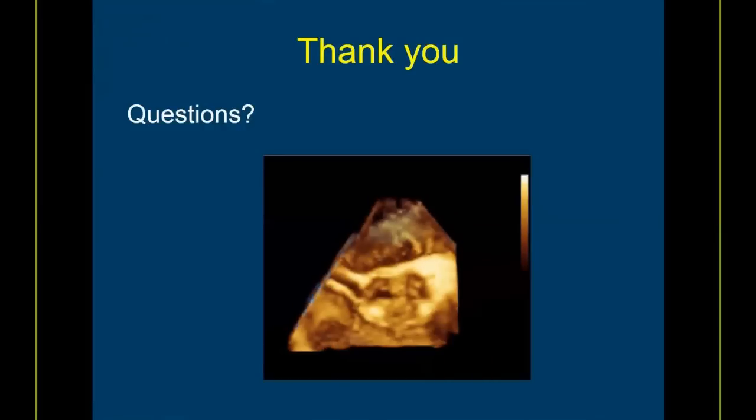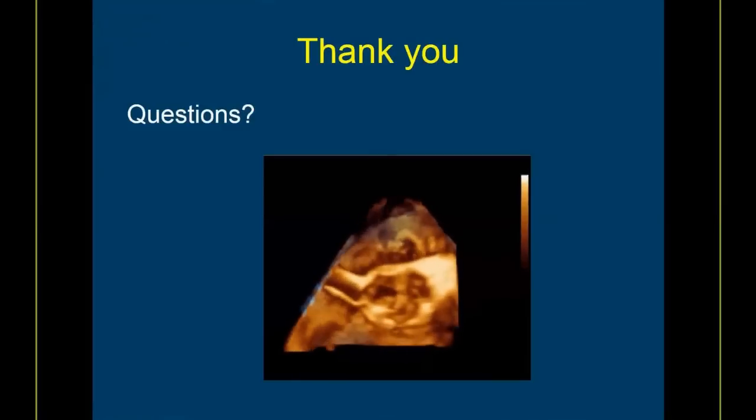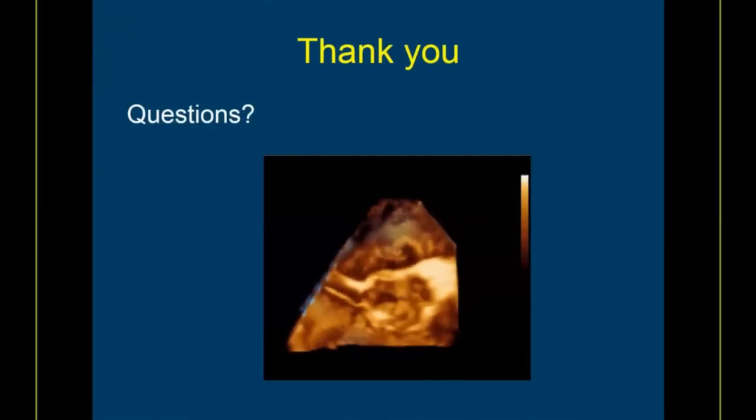Another question is, can you use V1 from the continuous wave Doppler spectral pattern with a double envelope? What this person is referring to is that with continuous wave Doppler, you'll also get your V1 profile within your V2 profile. I'd like to get my V1, if at all possible, using a pulse wave, because with a pulse wave I can control the sample volume. It should be in the LVOT area where I'm also measuring my LVOT diameter. So ideally, pulse wave is what you want.